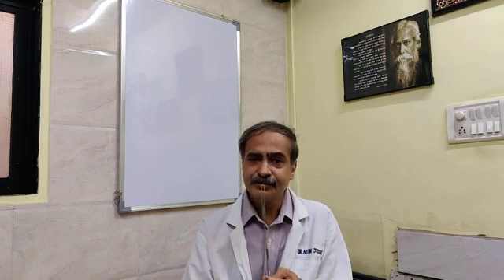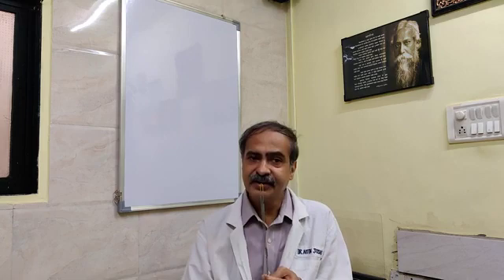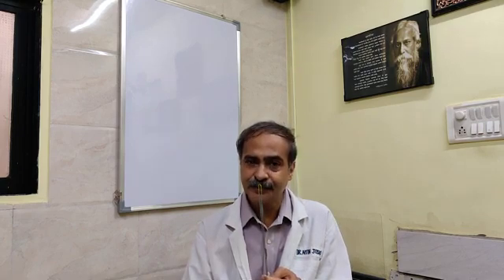At 6 o'clock position, because of posterior commissural hyperplasia, there will be significant adenomatous tissue. You evaluate whether, after the resection of the cone at the bladder neck, the bladder neck is still elevated with respect to the flat trigone.